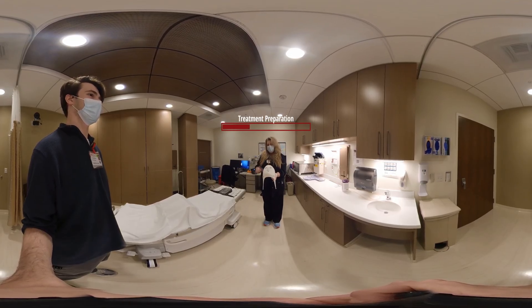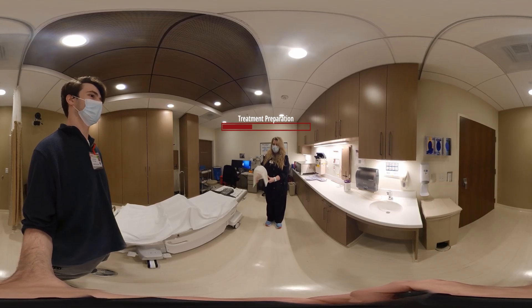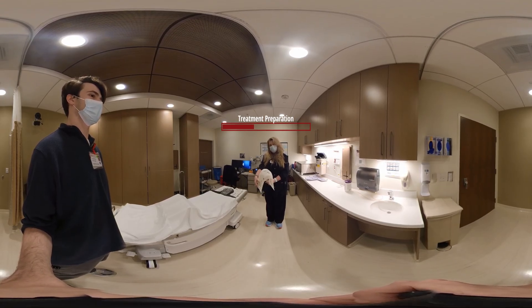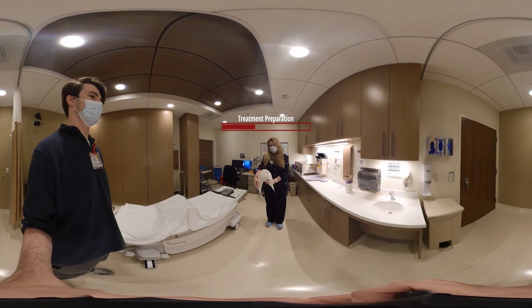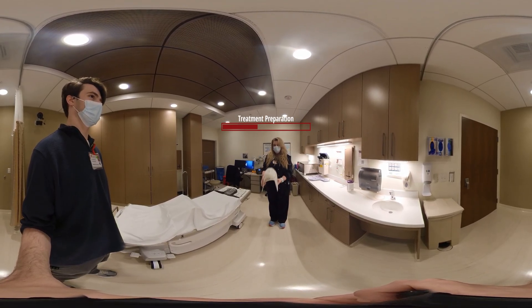During this, we can actually, as you can see by our lasers, mark you in an actual pattern for treatment and line you up daily in a consistent treatment pattern for aligning every single day.